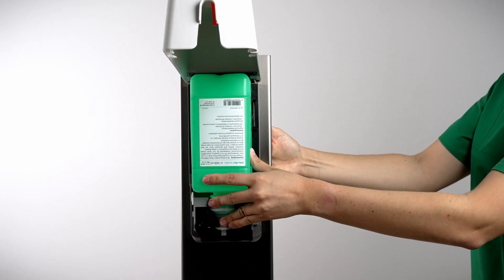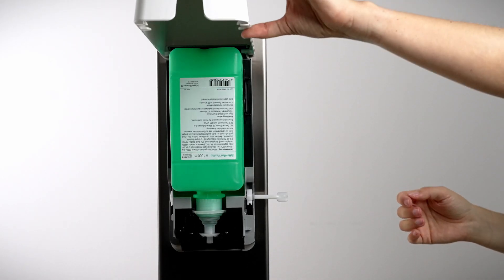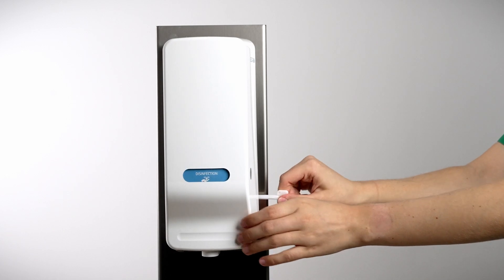When used for the first time, the dispenser will automatically perform a ventilation lift to release the air from the pump. From the next use, the set dosing amount is dispensed.